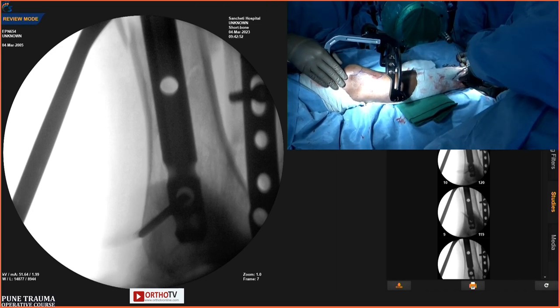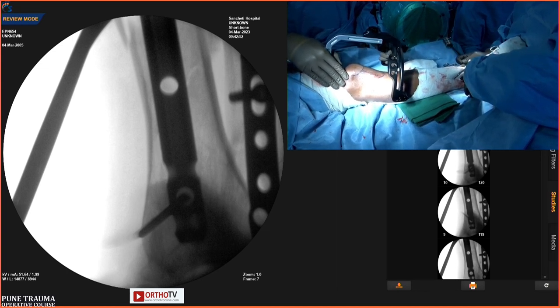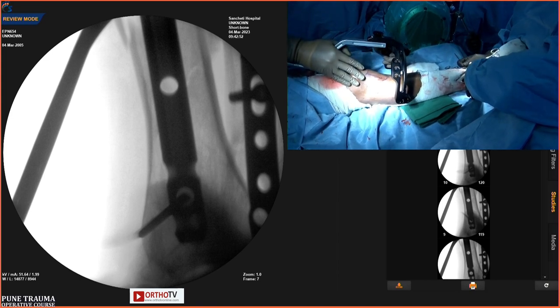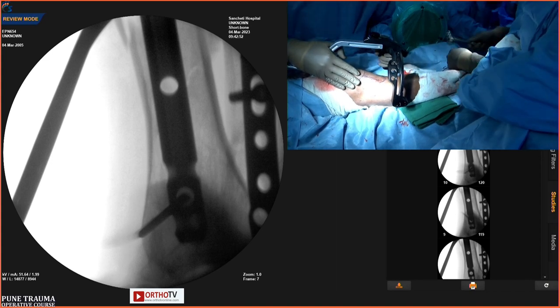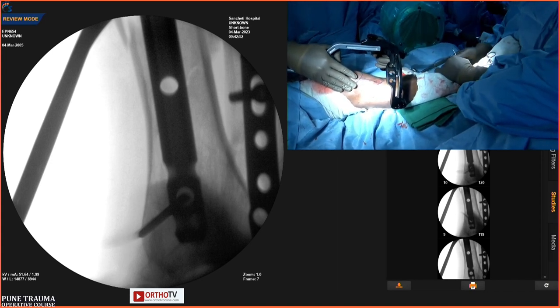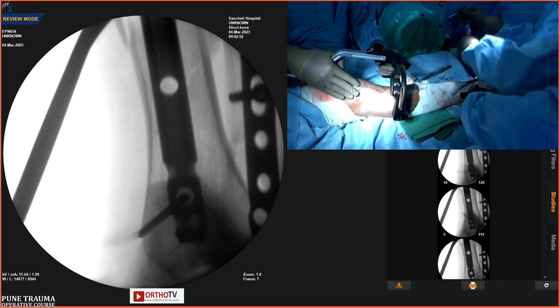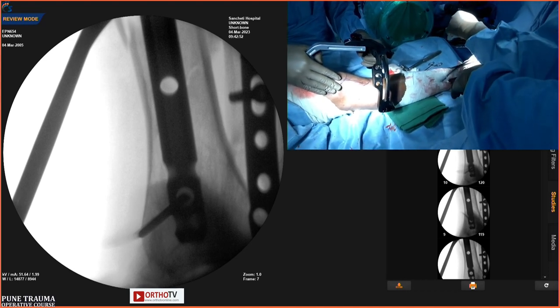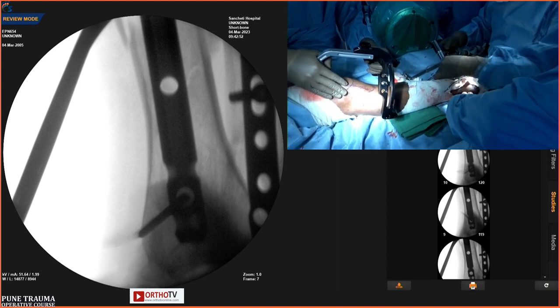About measuring length in distal third tibias, 50% of the time your nail will be either too long or too short, by whatever measure you use. So take an 8 millimeter nail. What you think is right will require 3 or 4 minutes of changing the nail. Pass the 8 millimeter nail, and then you are 100% sure whether the nail is longer or shorter, and then choose the right 10 millimeter nail. So use a thinner nail as a trial nail.